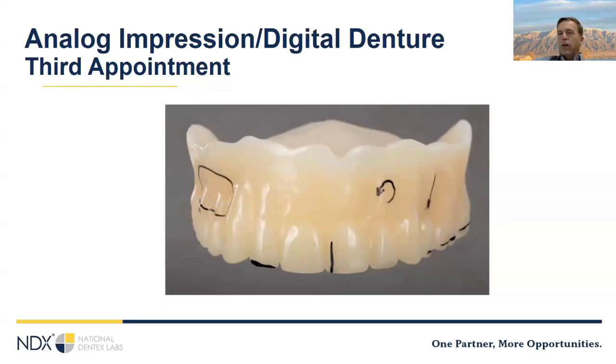The other thing that's cool, if you want to do a digital process, you can rescan after adjustments. If you want to send the prosthetic in, you can do this. You can mark, hey, I want to add more here, rotate this tooth, fix that length, shorten, move the midline. Obviously, you can grind on it or add to it. It's a type of composite. So if you want to do that, you certainly can as well. So you have a much more robust try-in prosthetic.